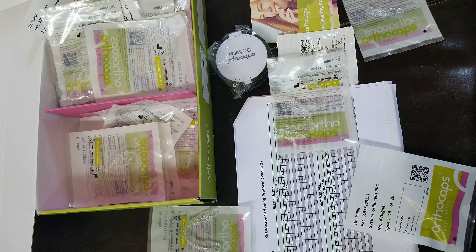Another thing that's different is the AM and PM aligners. For each aligner stage, you actually have two separate bags — one upper, one lower — and each bag has two aligners, so you have a total of four aligners per stage. You have your AM aligner which is really clear and transparent, and then the PM aligner which is almost like a night guard — you can barely bend it, see how thick it is. The idea is that it's much more aesthetic during the day and then the real movement occurs at night, and there's some science to back that up. I think they're the only ones that do it that way.